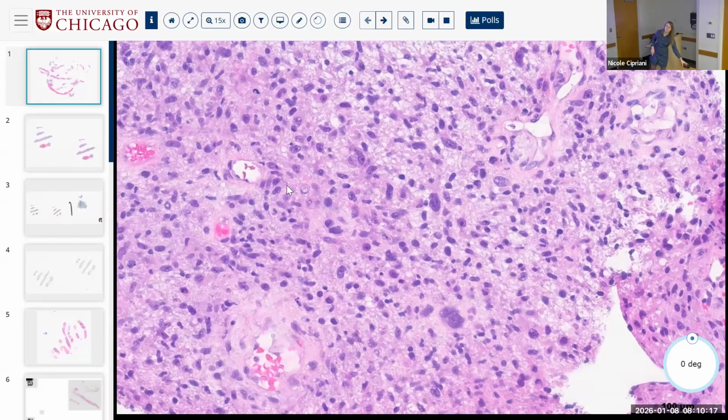This is all stuff the boards is going to ask you. So if you're thinking about dedifferentiated liposarcoma: MDM2, CDK4, chromosome 12, amplification. Sometimes P16 is thrown in there because there's one paper that says if you have at least 2 of those 3 positive in your tumor, that's predictive of amplification of that segment of chromosome 12. So MDM2 plus CDK4, MDM2 plus P16, CDK4 plus P16, any of that combination. You can throw those on here, and I will tell you that they're all going to be negative.